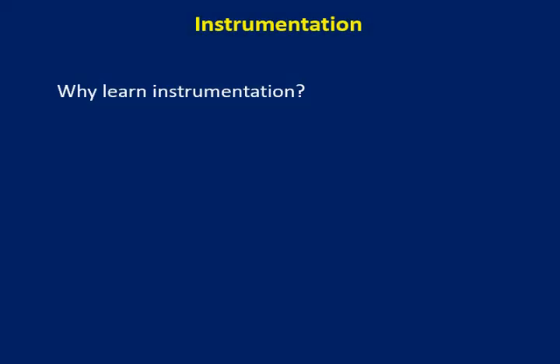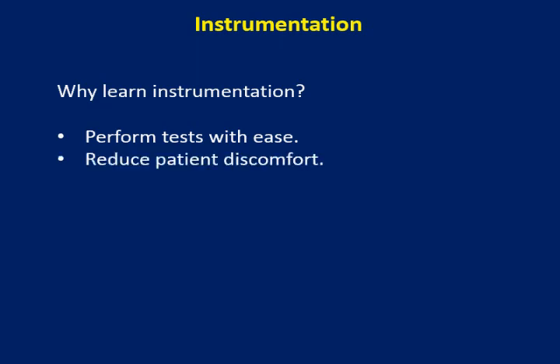Instrumentation is an important part of the electrodiagnostic study. An operator who is familiar with the instrument settings can navigate through the test procedures quite easily. This not only reduces the time of the EDX study, but also reduces the patient discomfort. When unexpected results or waveforms occur, the user can quickly examine if that represents a real abnormality or an artifact.